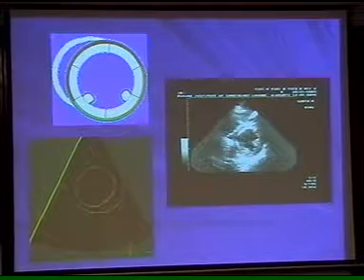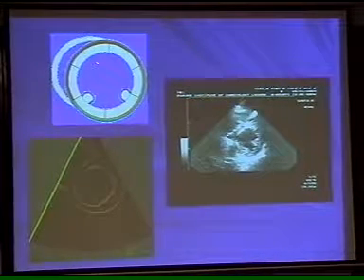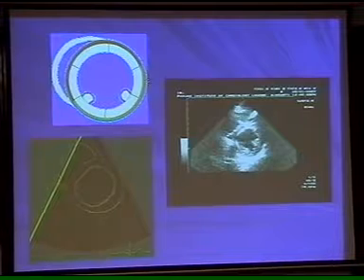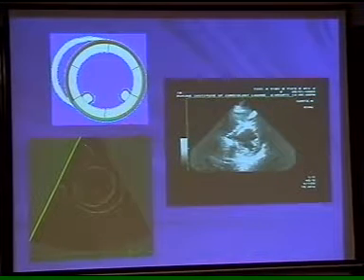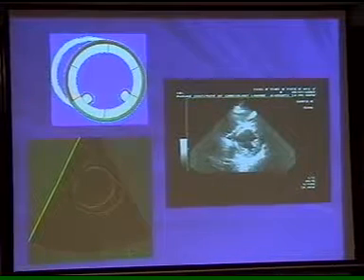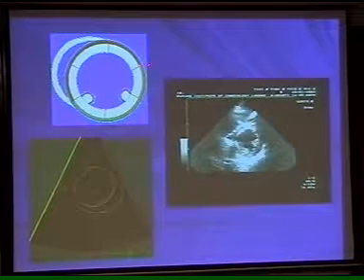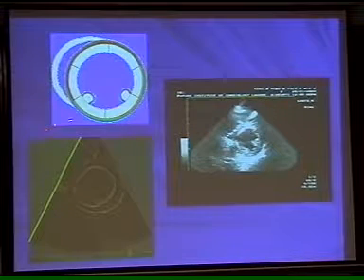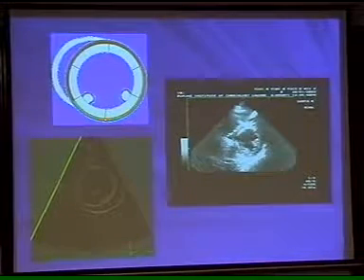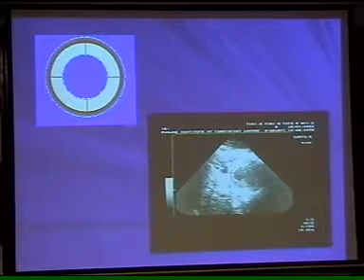Going still further down towards the apex, at papillary muscle level, these are the 2 papillary muscles, and again 6 segments. Since this is the mid region: mid anterior septum, mid anterior wall, mid anterolateral, mid infralateral, mid inferior and mid inferior septum. Now the LAD territory has extended from the previous one, from inferior septum to the region of anterolateral region. And this is the right coronary artery, this is circumflex territory. This is reducing and this is increasing. Still further going down, the apex we divide into 4 segments, so totally there are 17 segments.